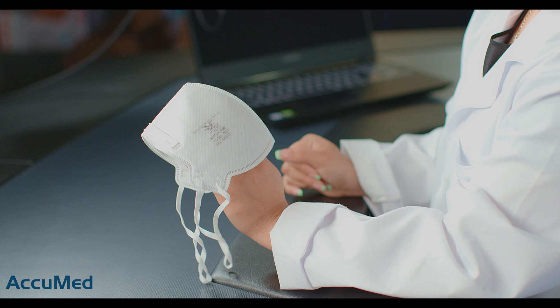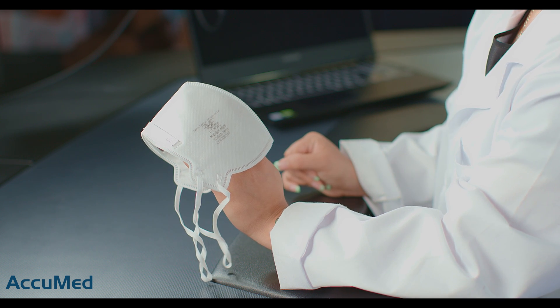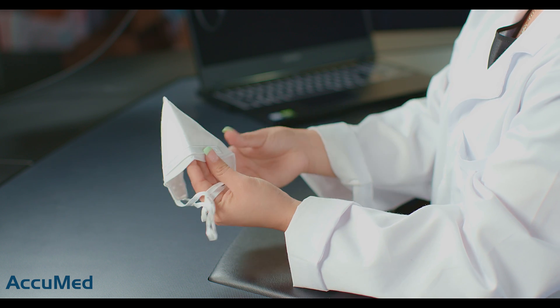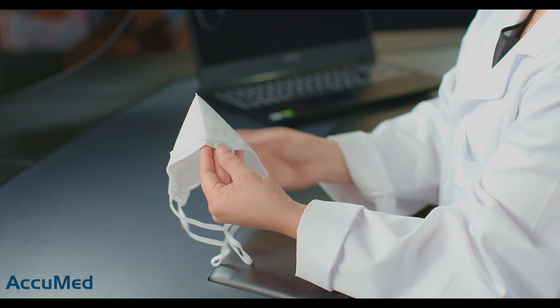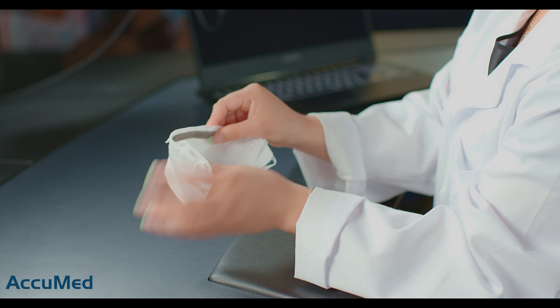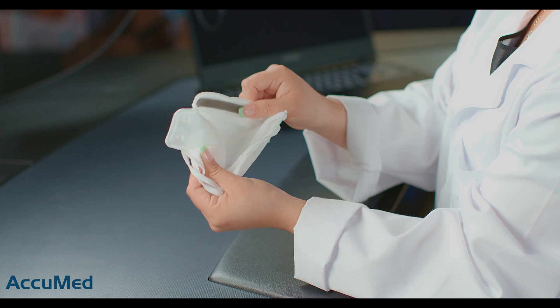Now let's take a look at these respirators. It does come with all the N95 requirements: the manufacturer name, model, NIOSH and N95 stamp with the TC approval number, and the lot number. There is a plastic nose wire on the outside of the respirator, which personally is not my favorite, but it does come with a nose foam. The material for both the inside and outside is very rough, and the respirator is also very thin.